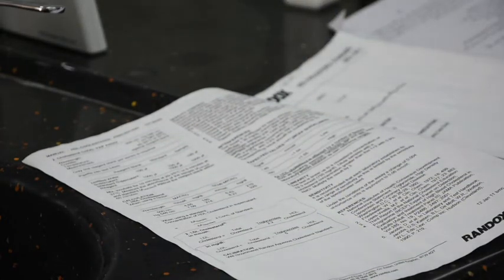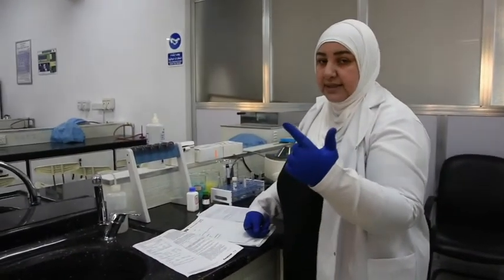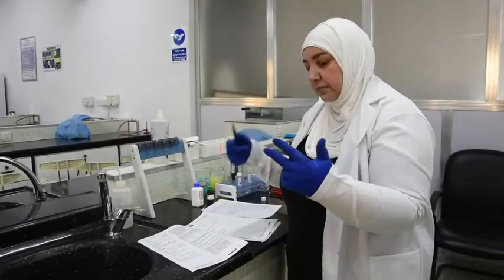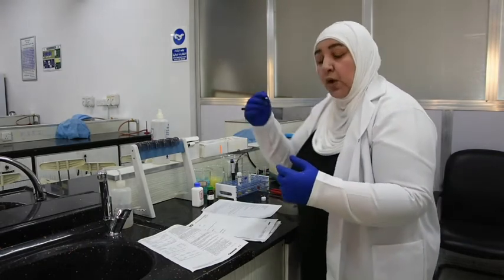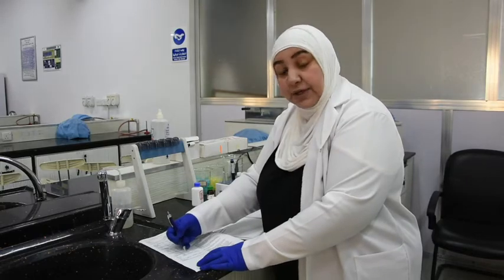Now, in the 3 parts above, we found the concentration of cholesterol, TG (triglyceride), and HDL cholesterol. Then we must find the LDL concentration by this equation.